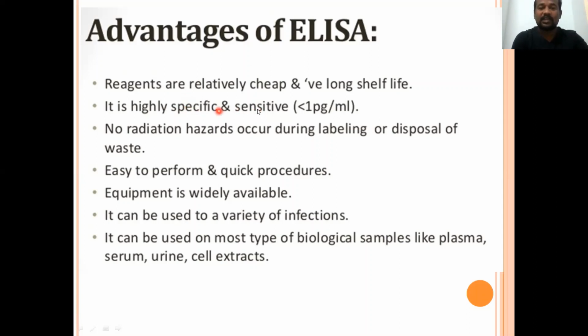So, specific and sensitive. Then there is no radiation hazard, since we are using an enzyme conjugate for detecting the antigen or antibody. We are not using any radioisotopes like in radioimmunoassay. So there is no radiation hazard. It's an easy to perform and quick procedure. Yes, quick procedure.